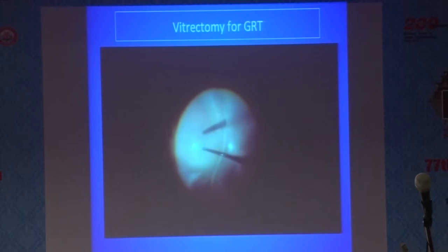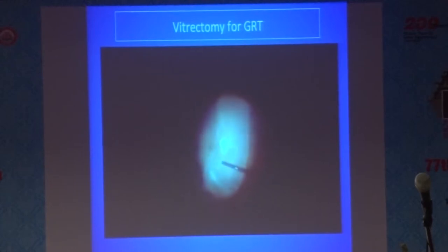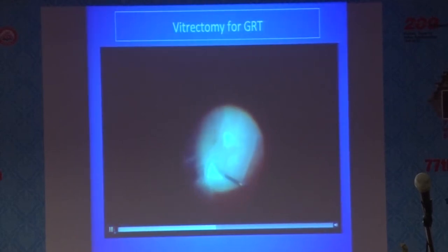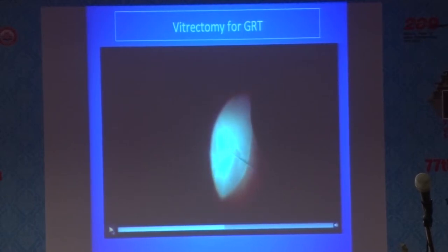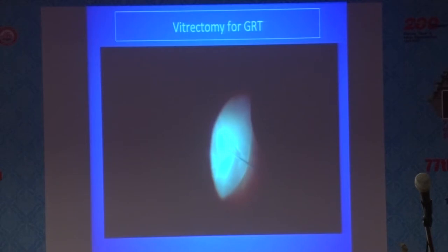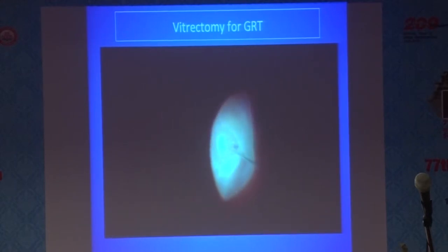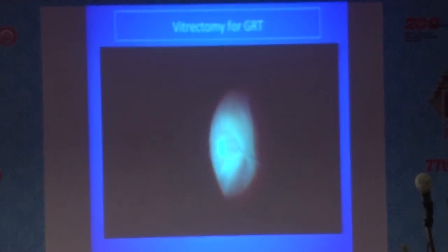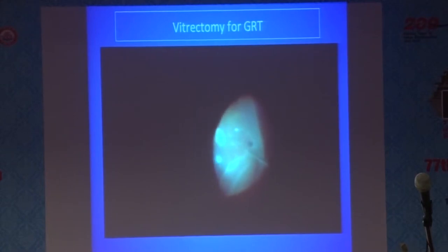In most idiopathic cases such as this, there is a pre-existing posterior vitreous detachment, so the core vitrectomy is completed. This is followed by injection of PFCL — an important step. When injecting PFCL, start over the disc, and the tip of the injector must lie within the PFCL bubble. The injection has to be slow; this prevents formation of PFCL fish eggs. Take care to remain posterior to the flap, because if you inject too fast, PFCL will enter the subretinal space and break into multiple bubbles. Slow injection with the tip continuously within the bubble will prevent this.